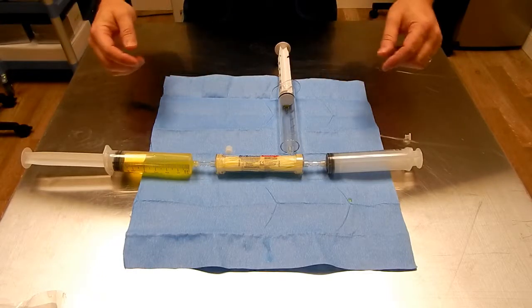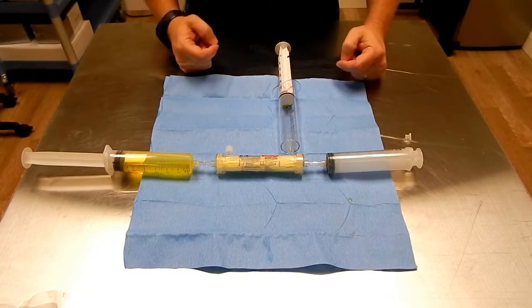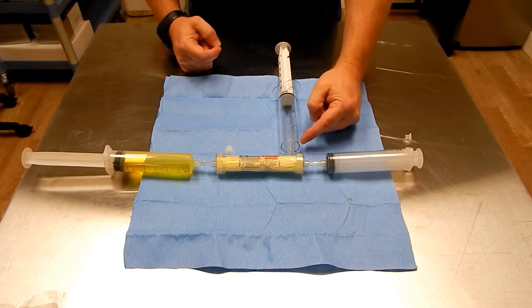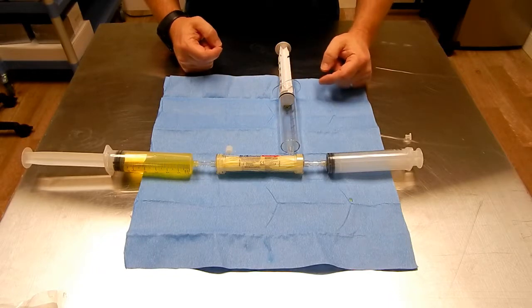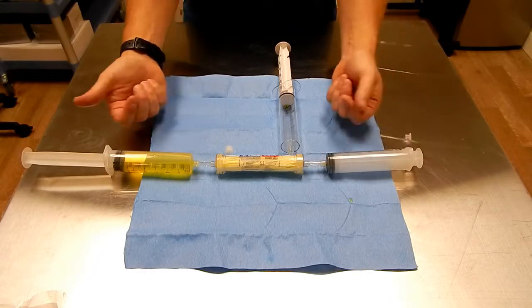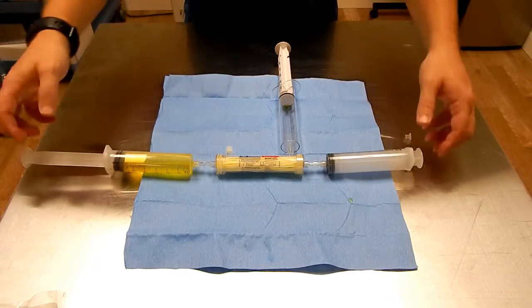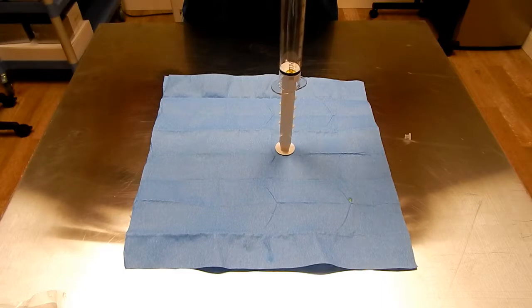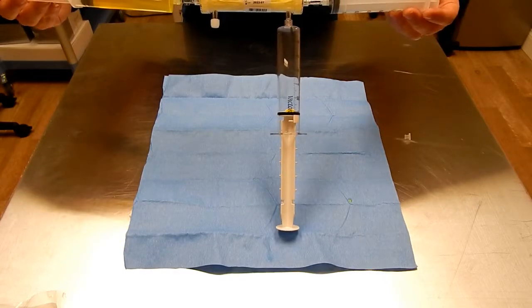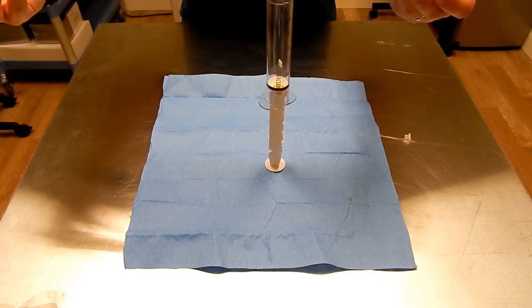Once everything is connected, you will then begin to transfer your platelet poor plasma through the Hema Concentrator into the other 60 ml syringe. During this process, the VacuLock will apply pressure to remove basically all the water, and the Hema Concentrator will do the work as we move the PPP back and forth until we have about 8 cc's left in our original syringe. One operating tip: have your VacuLock syringe down so gravity will assist in the transferring of the fluid. With all your lure locks connected, this would be your starting point to begin concentrating the Fibrinogen protein and the A2M.